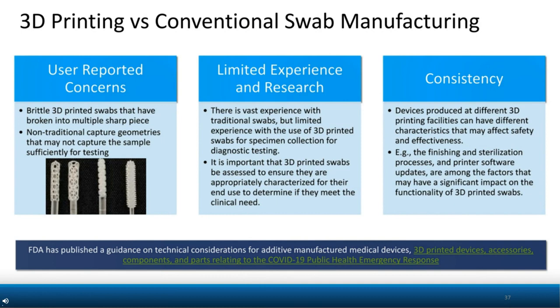We know that there was limited experience and research with these types of 3D printed swabs, although we know we have a lot of research over the many decades with using traditional swabs. We didn't have a lot of that same information for using these 3D printed swabs for diagnostics. And it is important that these swabs be assessed to ensure that they are appropriately characterized for, again, their intended use and to make sure that they do meet the clinical need.